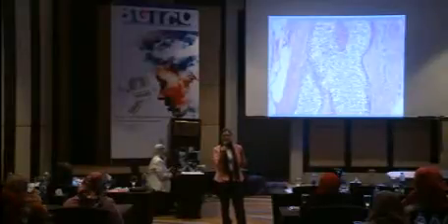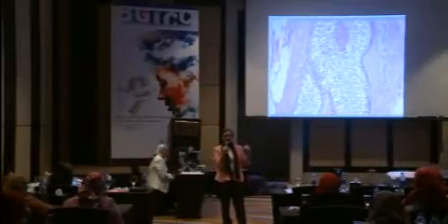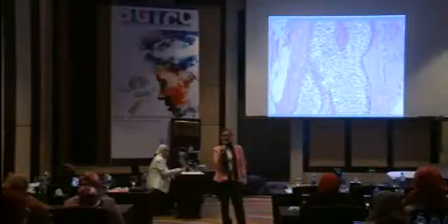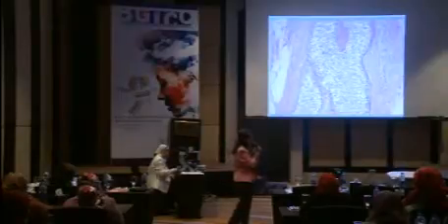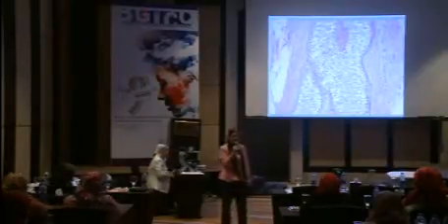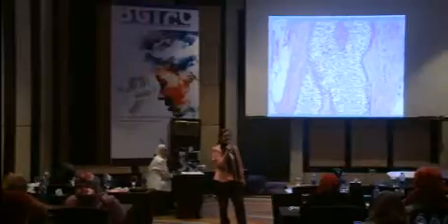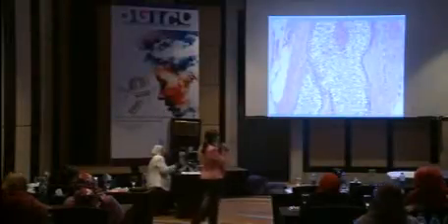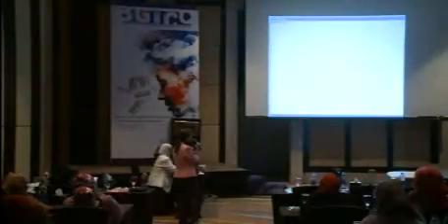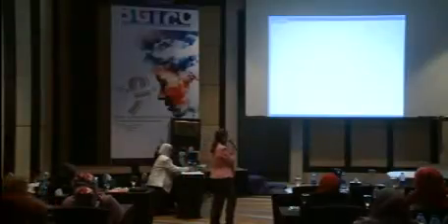So for us, E-cadherin expression versus lack of expression defines the lobular differentiation on these lesions. And this was E-cadherin negative in-situ proliferation. So based on that, we made the diagnosis of lobular carcinoma in situ. If we go around a little, there are definite areas where the nuclear morphology is a little more atypical. So based on that, we recommended that this is a pleomorphic lobular carcinoma in situ.